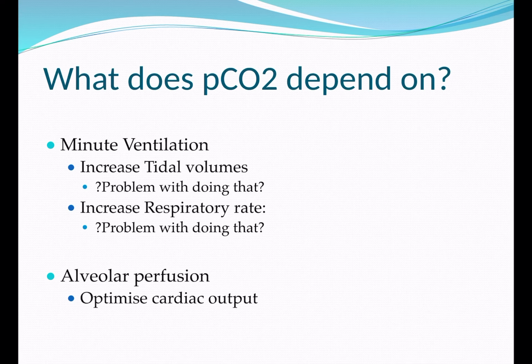But doing this can cause problems, and we'll go through this in a little bit of detail later in this talk. It's worth just thinking about increasing tidal volumes because you could go from 6 to 8 mils per kilo, but the problem with trying to increase the tidal volumes is that you are going to have to increase the pressure of the ventilator in order to be able to force that extra amount of air into the lungs.